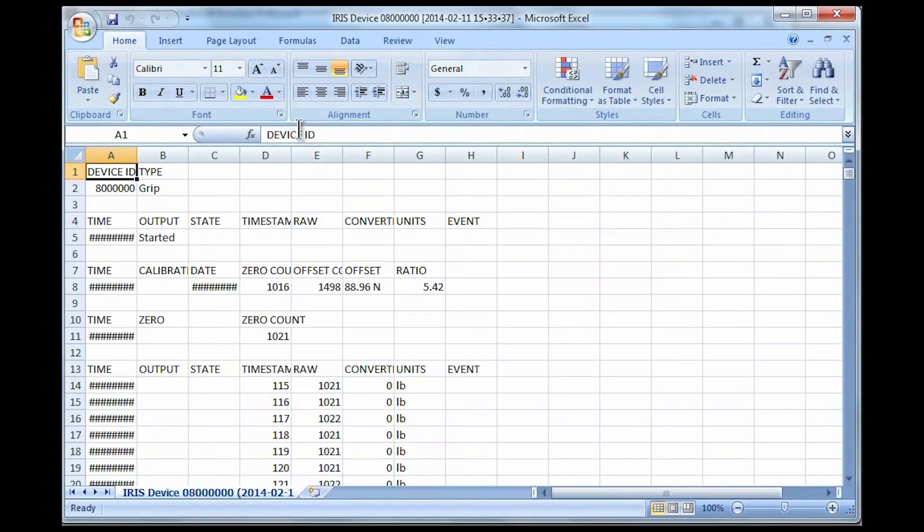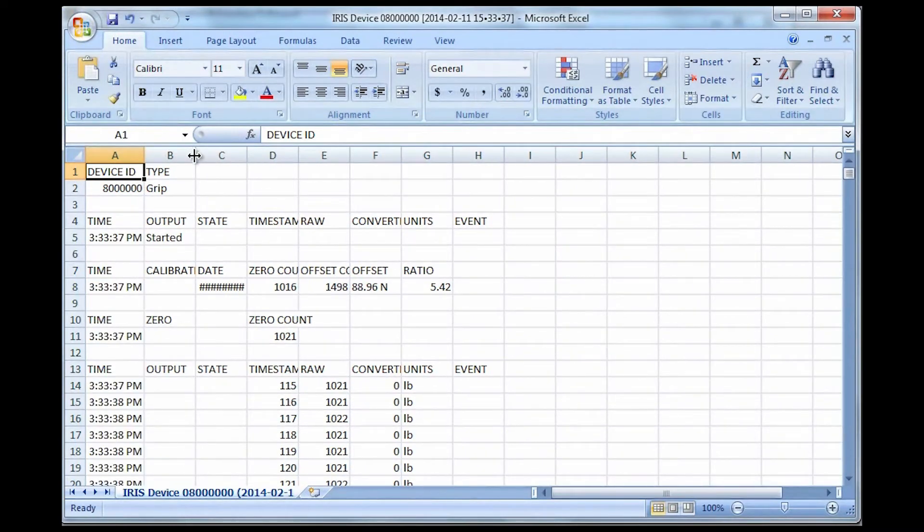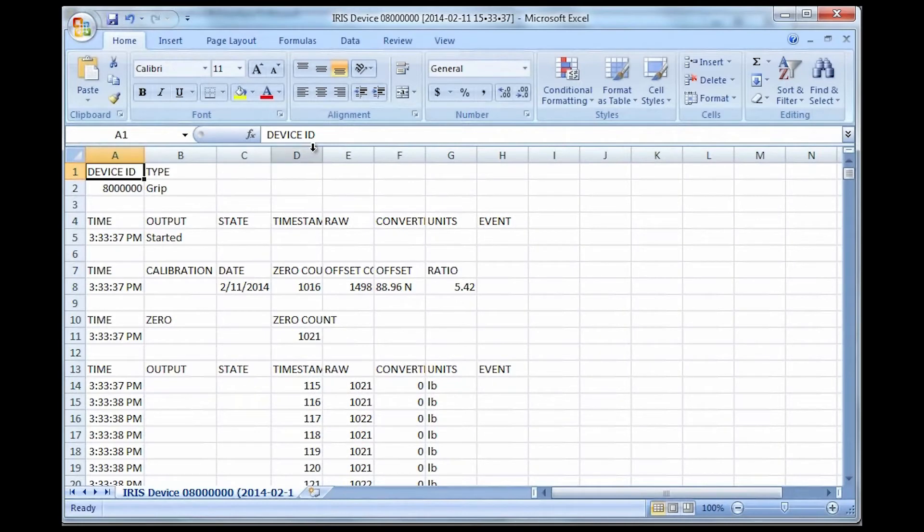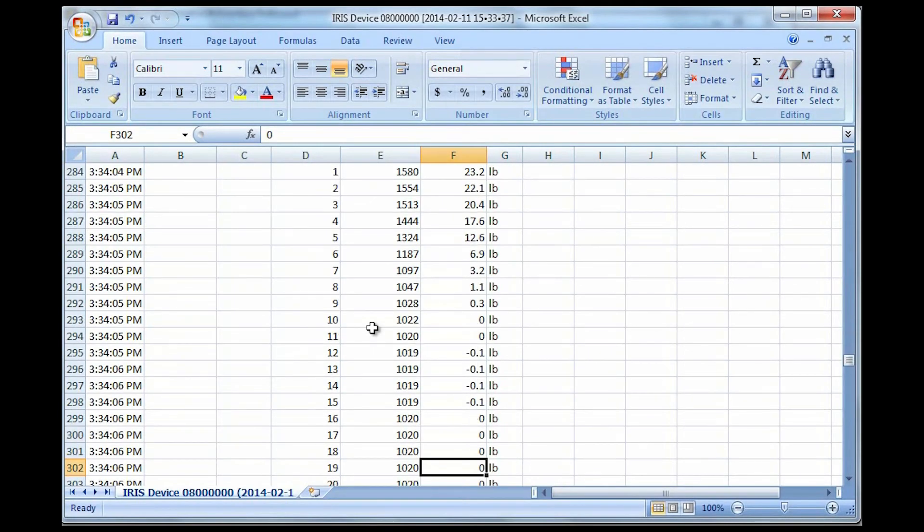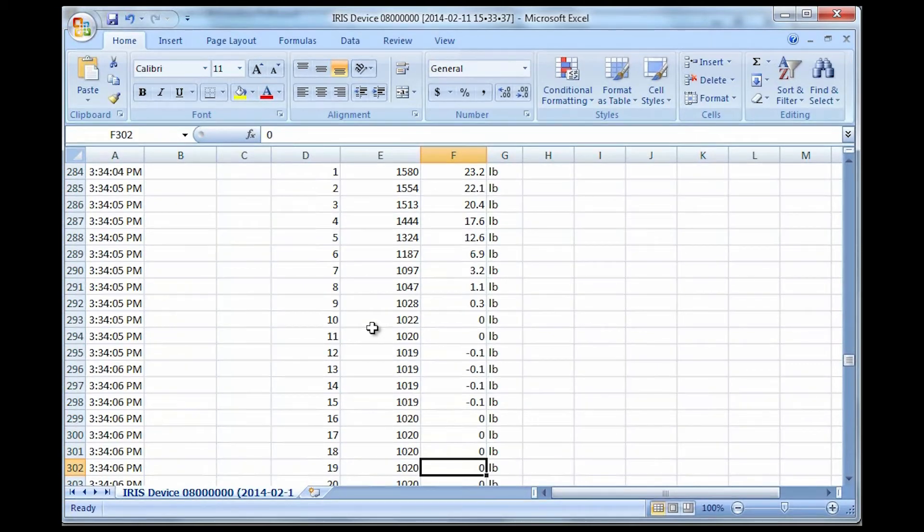Again by default comma separated values, and so it's going to open in my case in Microsoft Excel. So the raw data is pretty straightforward, you can use it in just about any capacity you need. You can use this to capture maximum values, sustain force curves just like you saw inside the IRIS interface, or extrapolate just about any data that you need from those raw data values.